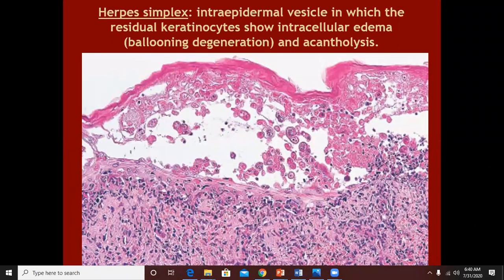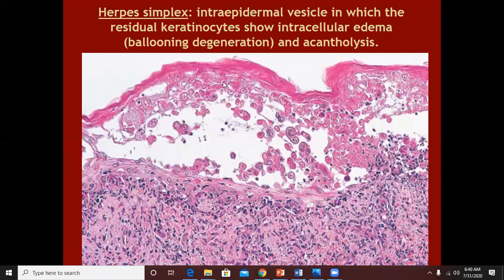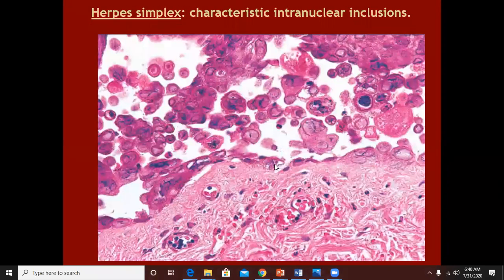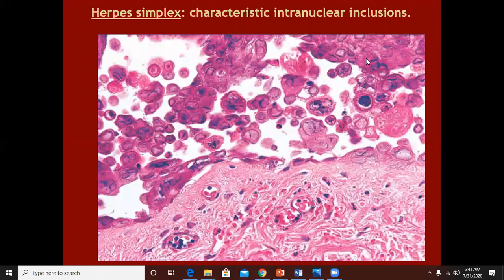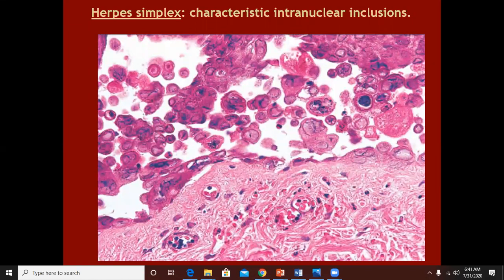You can see intraepidermal vesicle with some residual keratinocytes below, intracellular edema, balloon degeneration, bloated keratinocytes, and acantholytic cells. Now you see the typical viral inclusions — these are actually the virus particles. These black-colored structures are all viral inclusions involving the keratinocyte nuclei. The viral inclusions of herpes are intranuclear inclusions.